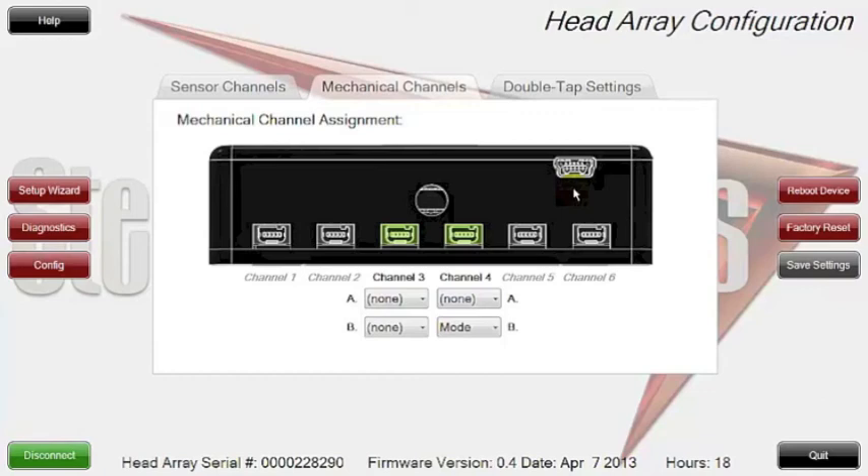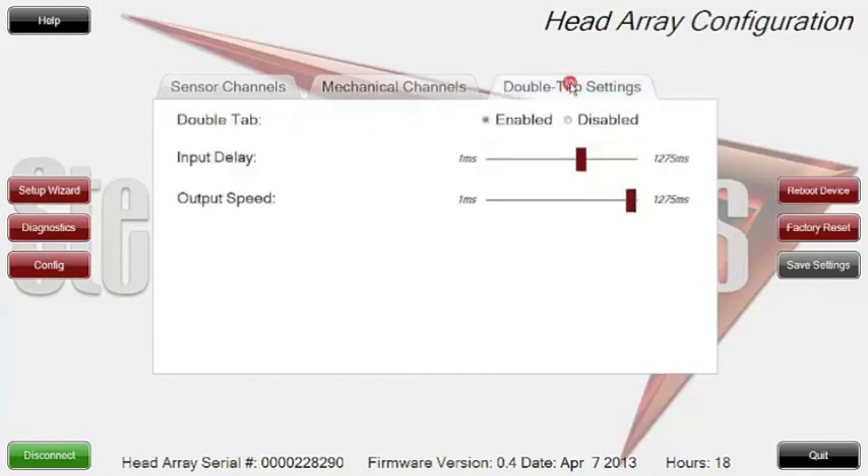We're going to now talk about the double tap settings. The double tap settings give you the ability to set or calibrate the inputs of the mode change and reset that will actually send a signal out to the chair. Sometimes you need to do a double click to get into a different mode or function, and the chair doesn't give you the option to easily access it, so we created this calibration mode.